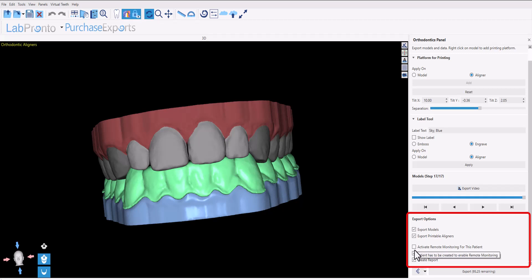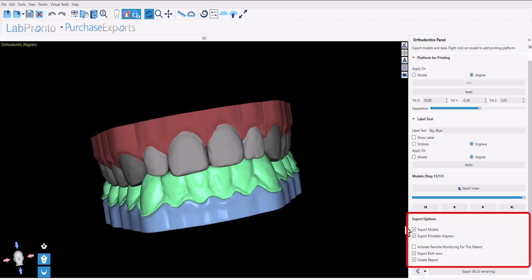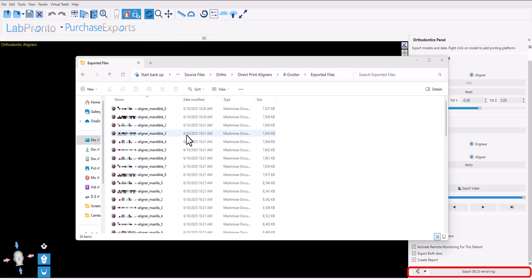We have the option of activating remote monitoring for this patient simply by clicking the checkbox here and following the few additional steps that will appear automatically on screen. Go ahead and click on the export button.